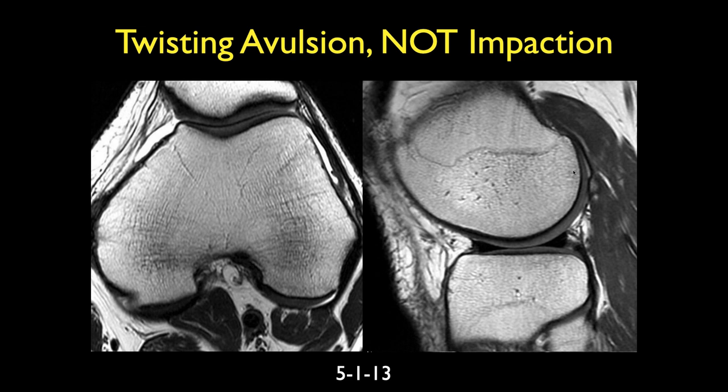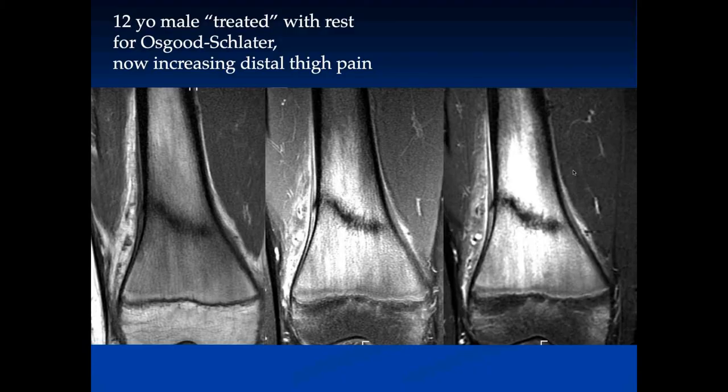We learned this long, long time ago, as I remember, John, that impaction produced a lot more edema than avulsion. Right. Avulsion didn't produce any edema at all. So I remember I said, my God, here's a fracture and there's no edema. There must be an avulsion. That goes back over 20 years. Yep. Close to 30.